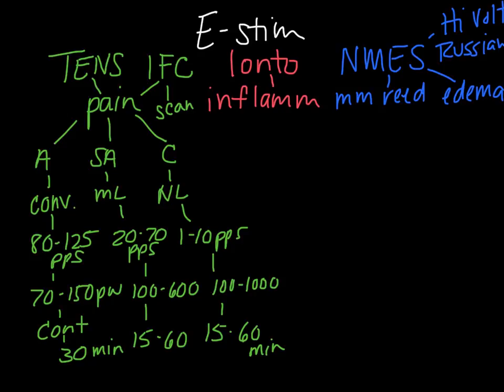And primarily in physical therapy, we're going to see the types of medications that are used to control inflammation. And so this is a pretty straightforward process. Your medication is going to have either a positive or negative charge, and that's important to know. And then we're going to actually deliver that medication.